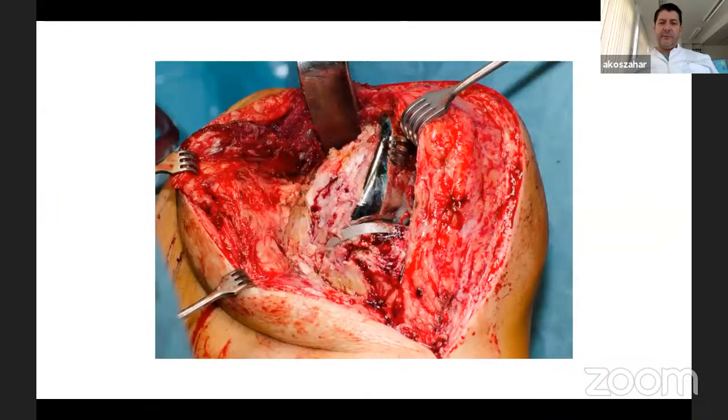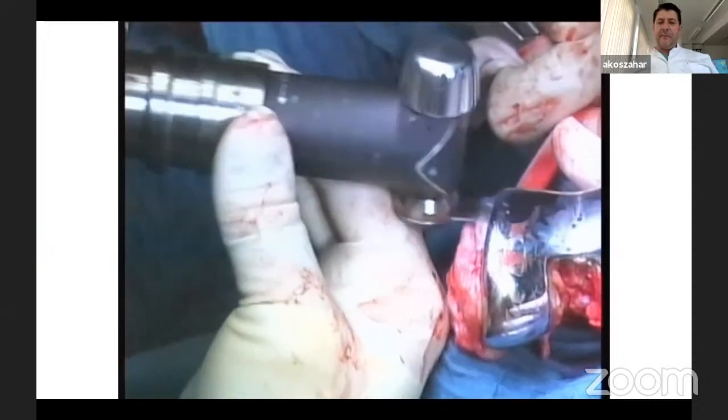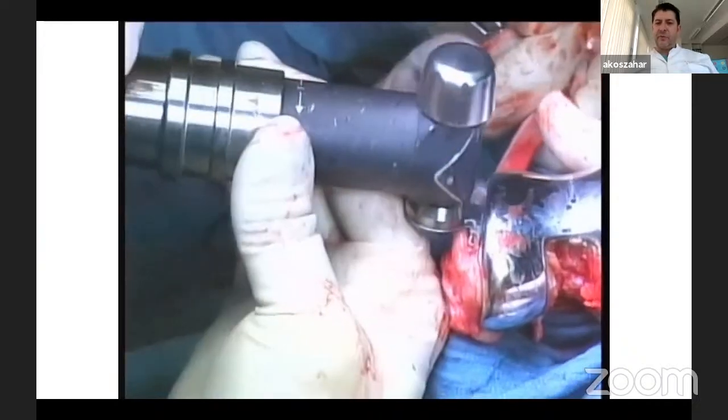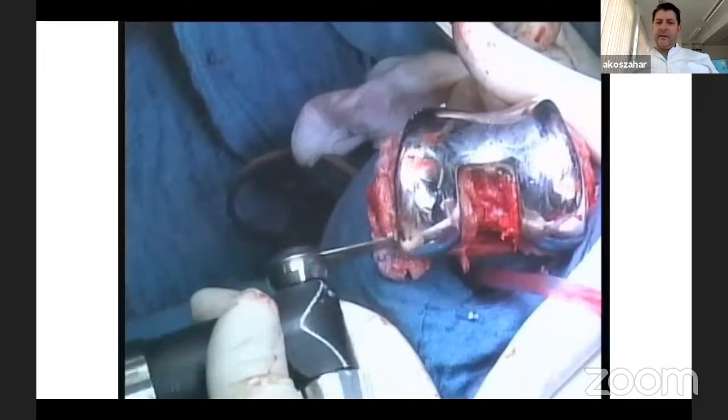Now I will show you some pictures of the knee. I know most of you are hip surgeons, but you can see here a knee with the approach. Here's how to mobilize the implant, which is solid. You use a power saw to mobilize the implant and the cement interface to remove the solid implant.